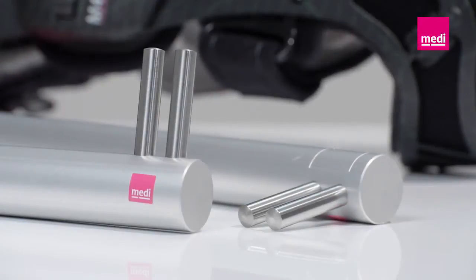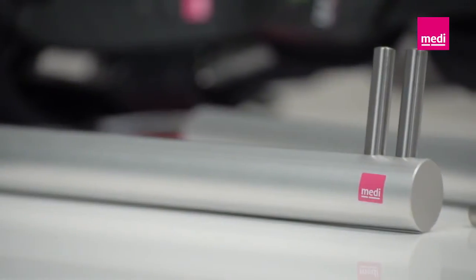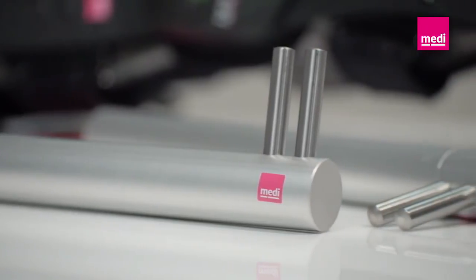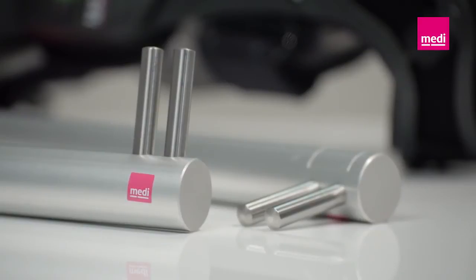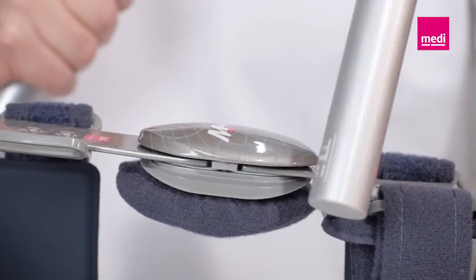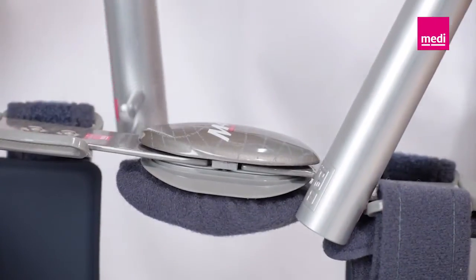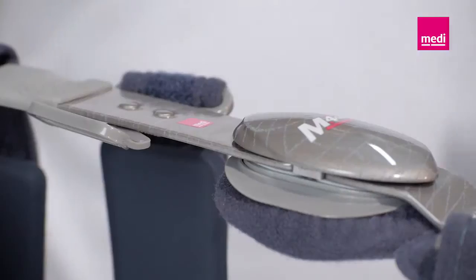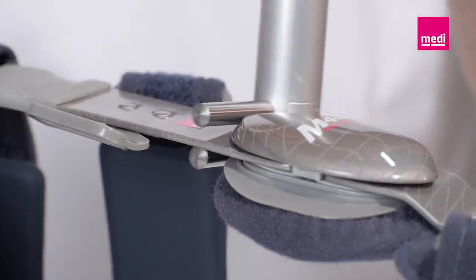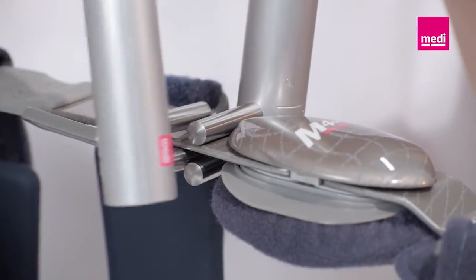The medi bending tool can be used to help mold the orthosis closely to the patient to guarantee the best possible fit. This prevents painful pressure areas and guarantees the best possible comfort in wear, especially in the case of varus or valgus deformities of the knee. Please note the following points when adjusting the orthosis: avoid damaging the hinges at all costs. The hinges should never get between the two bending tools. Always isolate the hinge from damaging forces by placing the counterpart in front of the hinge.